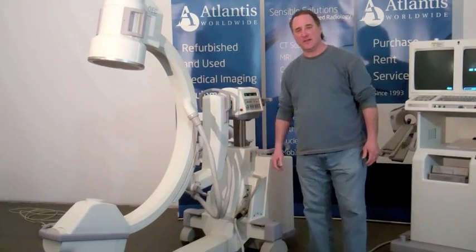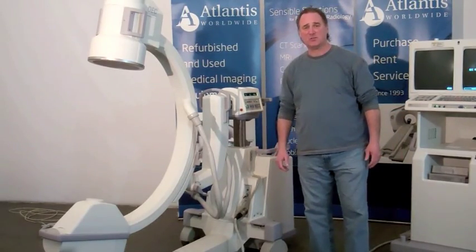Welcome back. Stuart Echols of Atlantis Worldwide. In this session, we're going to show how the movements of a C-arm work.